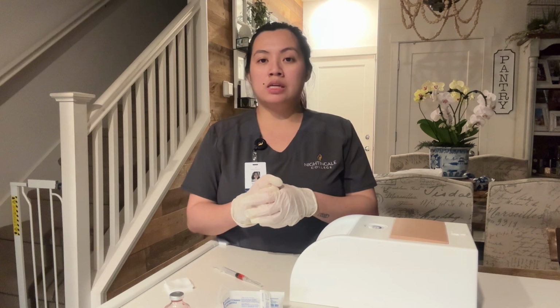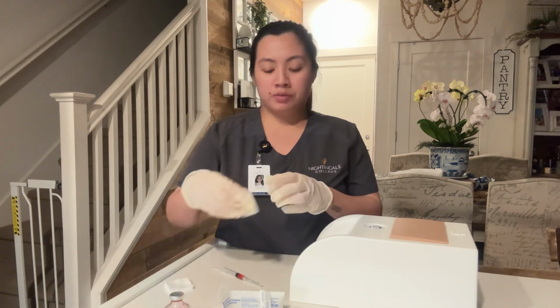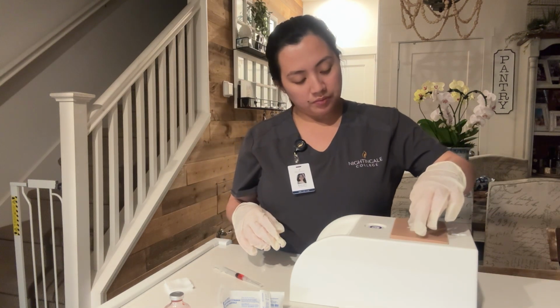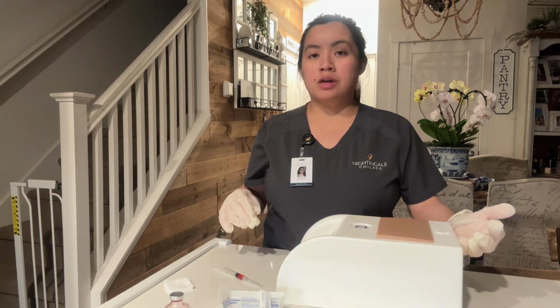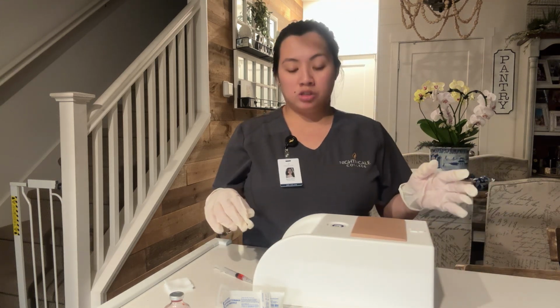And then we're gonna clean the site with an alcohol swab, starting from the center and moving outward in a circular motion, about 2 inches or 5 centimeters. And we're gonna allow the area to air dry completely without touching it.